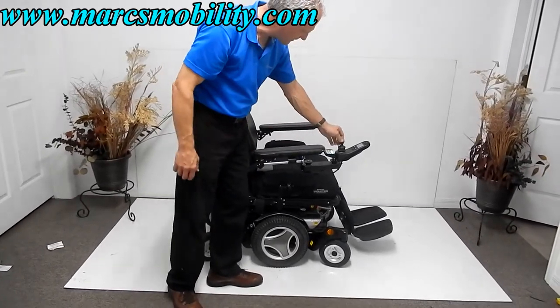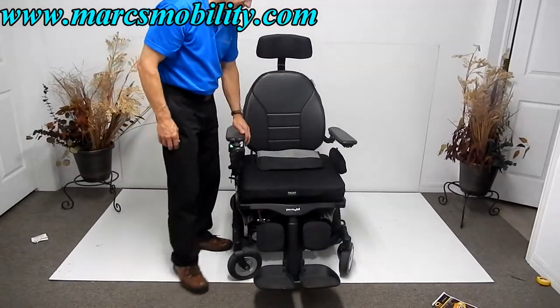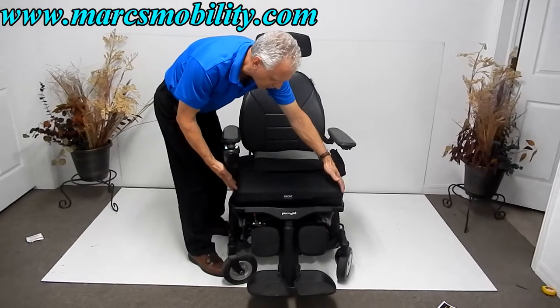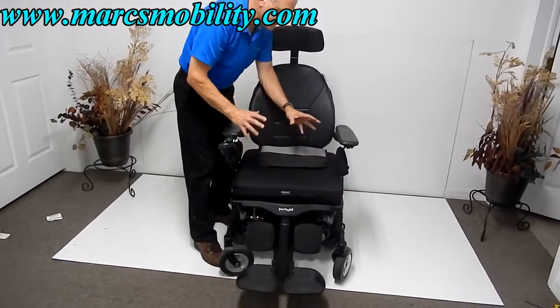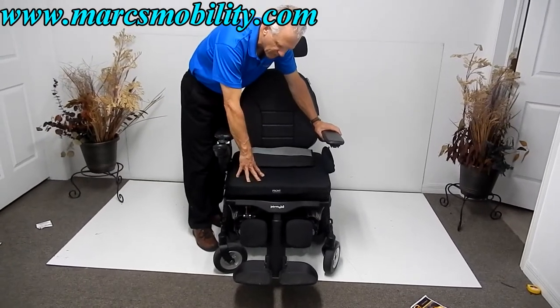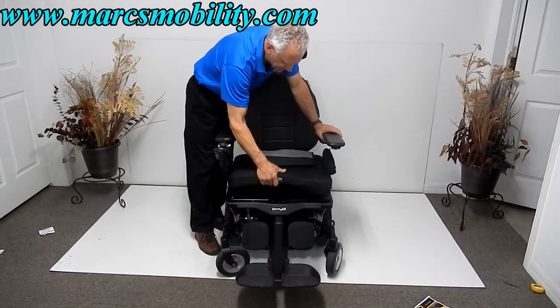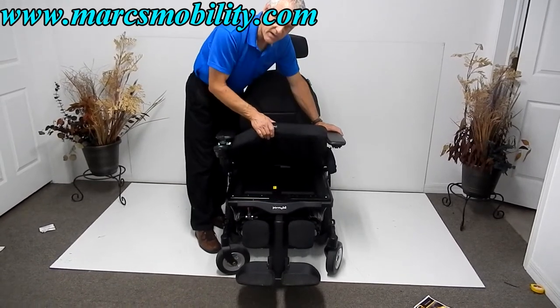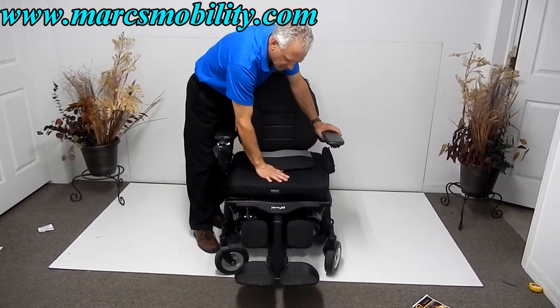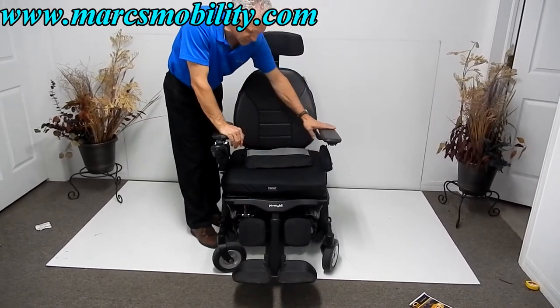I'm going to turn the chair around so you can see the front. The seat on this chair is 22 inches wide by 20 inches deep. These seats are adjustable, so this one is made for a large person because it is 22 inches wide. This is a floating cushion — you can remove it and put whatever cushion you want, such as a gel, air, or foam cushion.